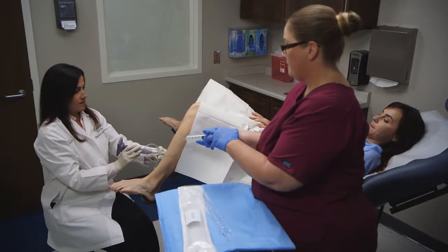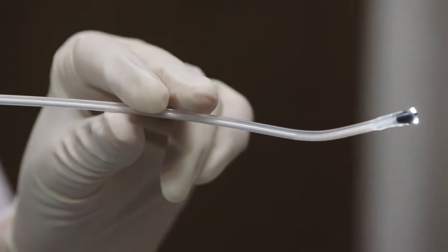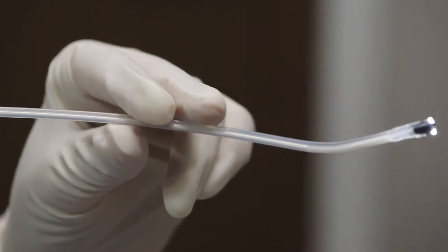EndoSea is now fully assembled and ready for use. The EndoSea cannula is less than five millimeters in diameter, similar to a pipel. The need for dilation, anesthesia, or anti-anxiety medication for patient comfort should be decided on a case-by-case basis.